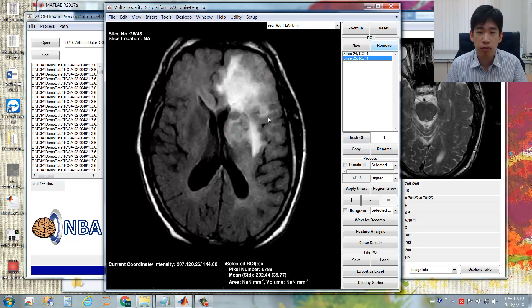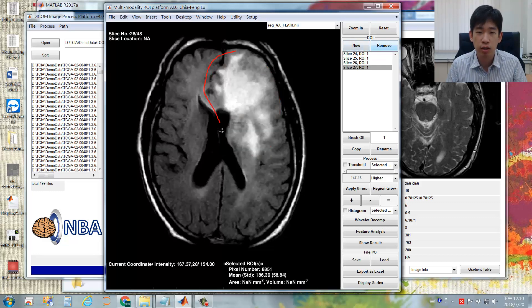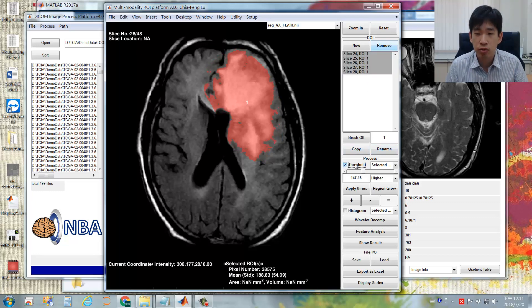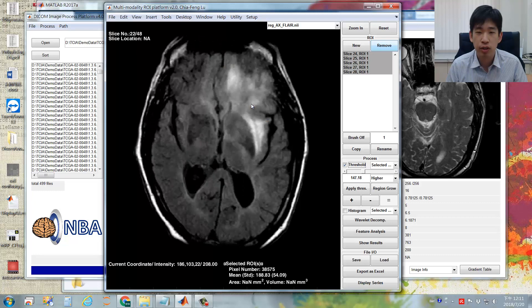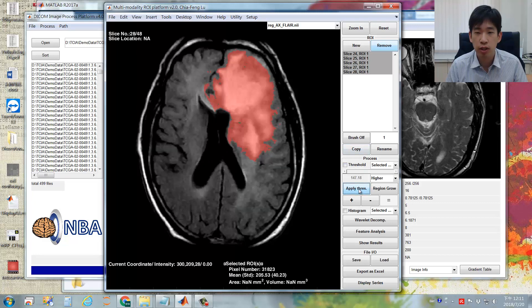You can create new ROIs in the next slice, and the next slice. Then select multiple ROIs using Shift, check the threshold checkbox, and apply the same threshold. Before clicking Apply Threshold, you can scroll over your slices to verify that the thresholding value is appropriate. Once you are sure, click Apply Threshold.